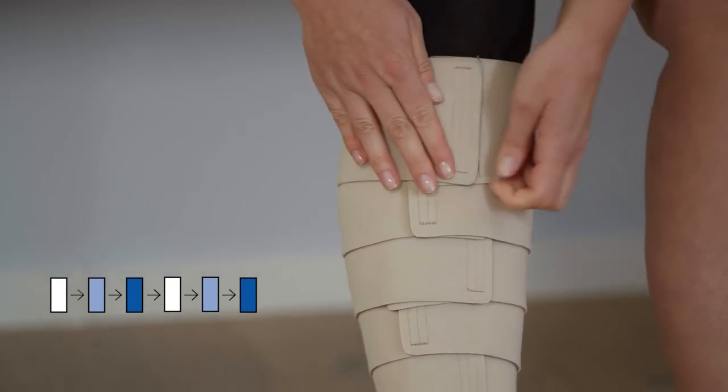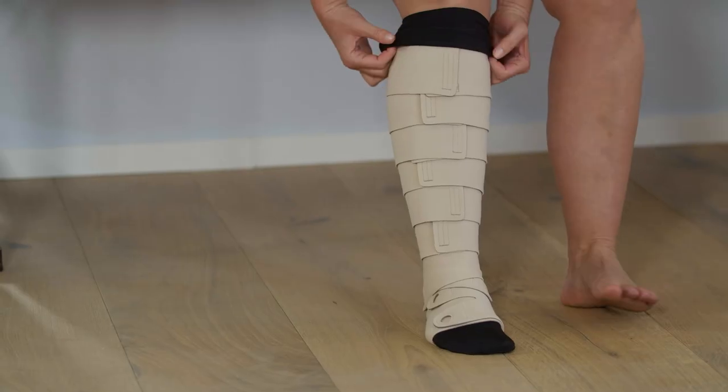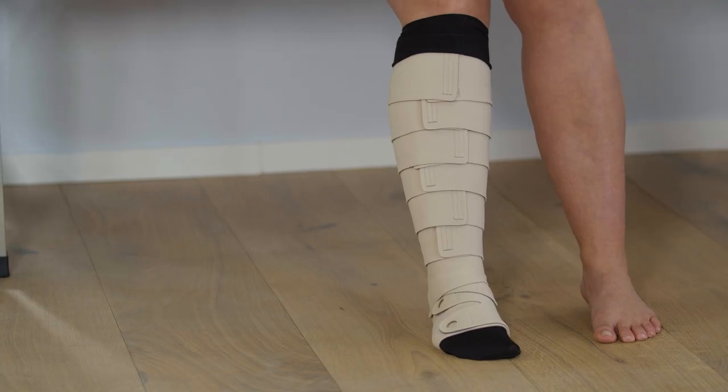The end of the liner should be a few centimetres above the calf garment. Now, fold this piece over the upper end of the wrap to prevent slippage.